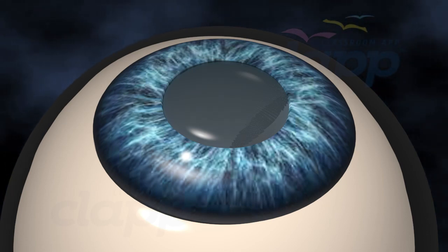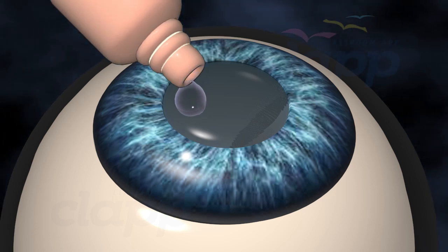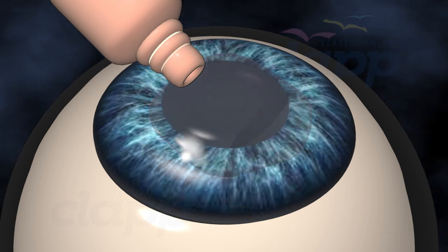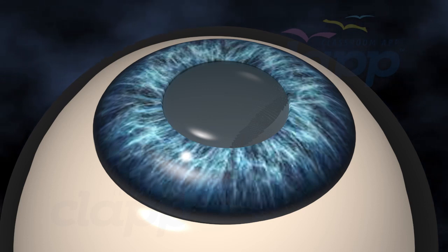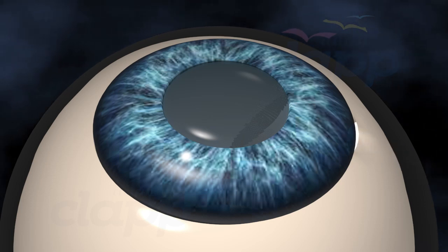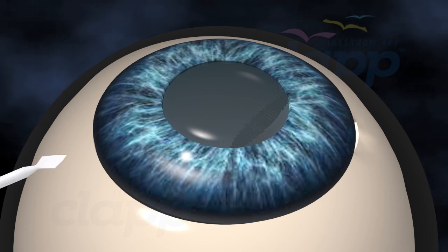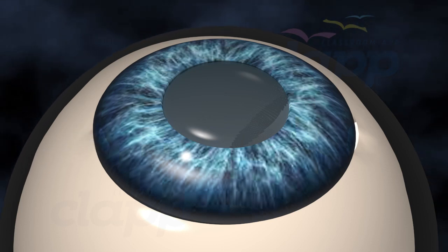You will be given local anesthesia to numb your eye, commonly eye drops, ensuring you are comfortable throughout the surgery. You will remain awake but won't feel any pain. Once you're ready, your surgeon will make a tiny incision around 2 mm in the junction between the cornea and sclera. One or two tiny incisions will also be made to enable manipulations at the time of surgery.